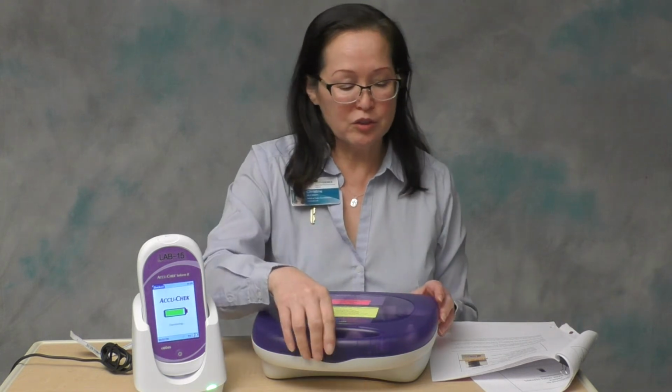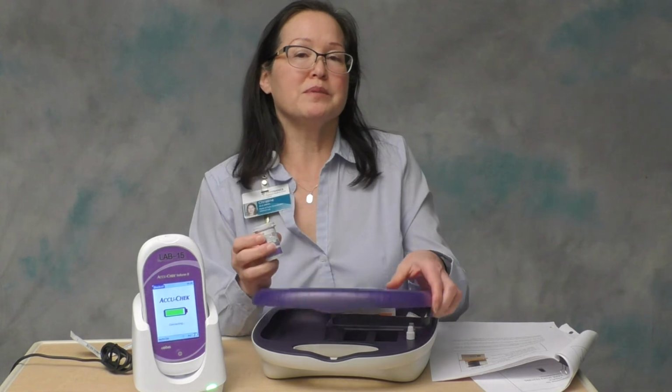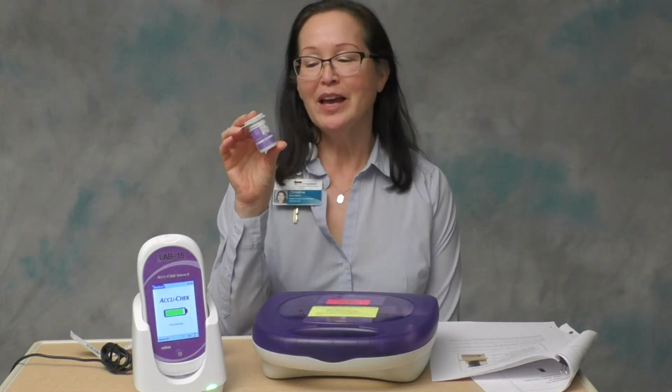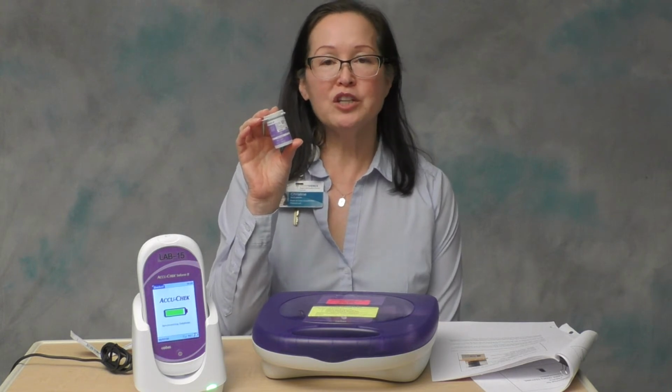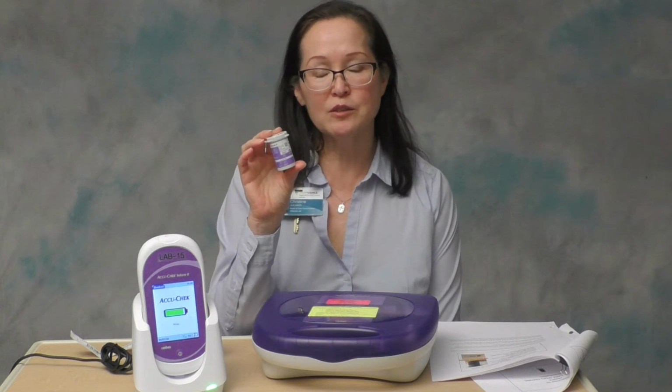Okay, we're going to move on to the reagents now. We consider the test strips the reagent because that's where the magic chemistry takes place. So there's a chemical reaction that will occur when the reagent in the test strip makes contact with either patient blood or the QC solution.